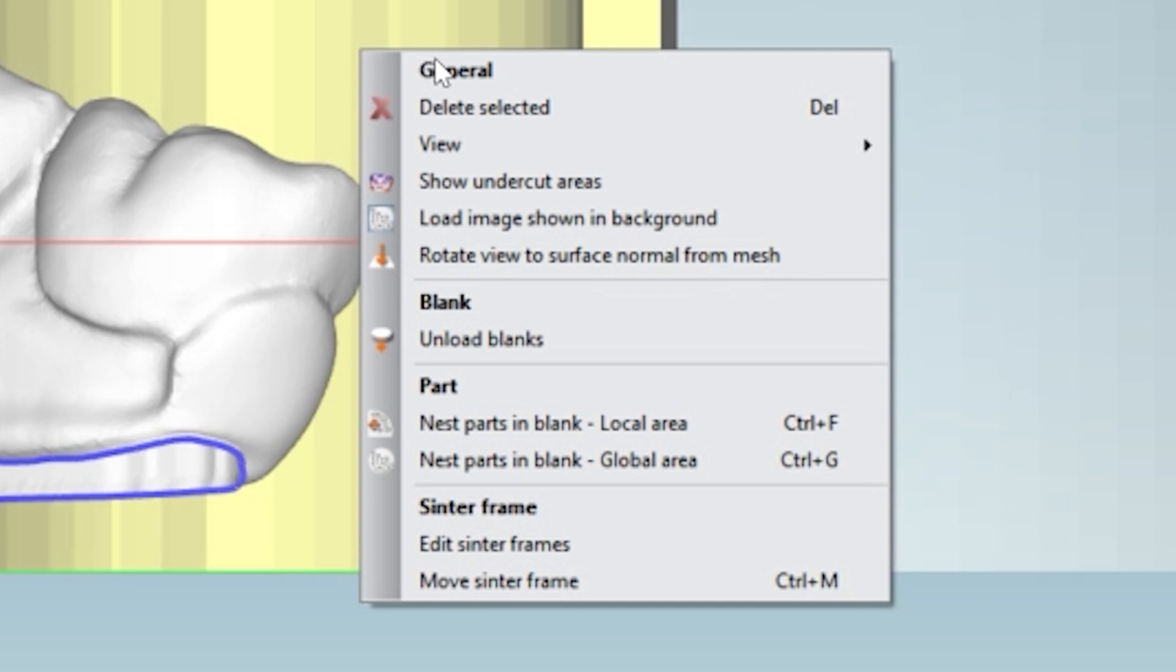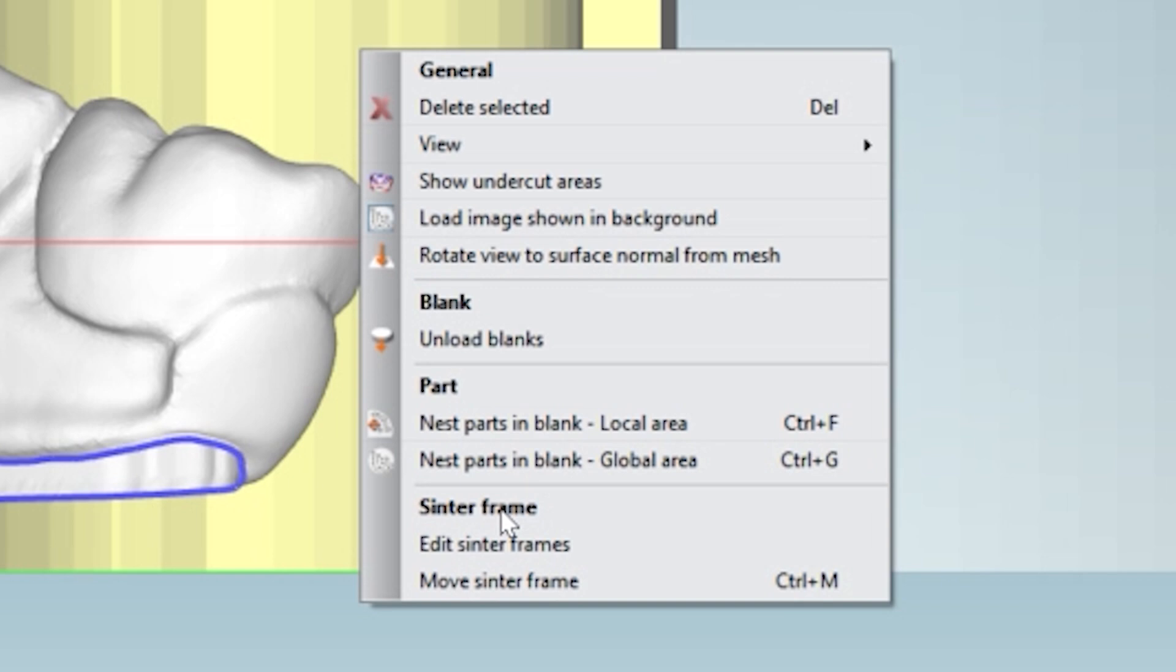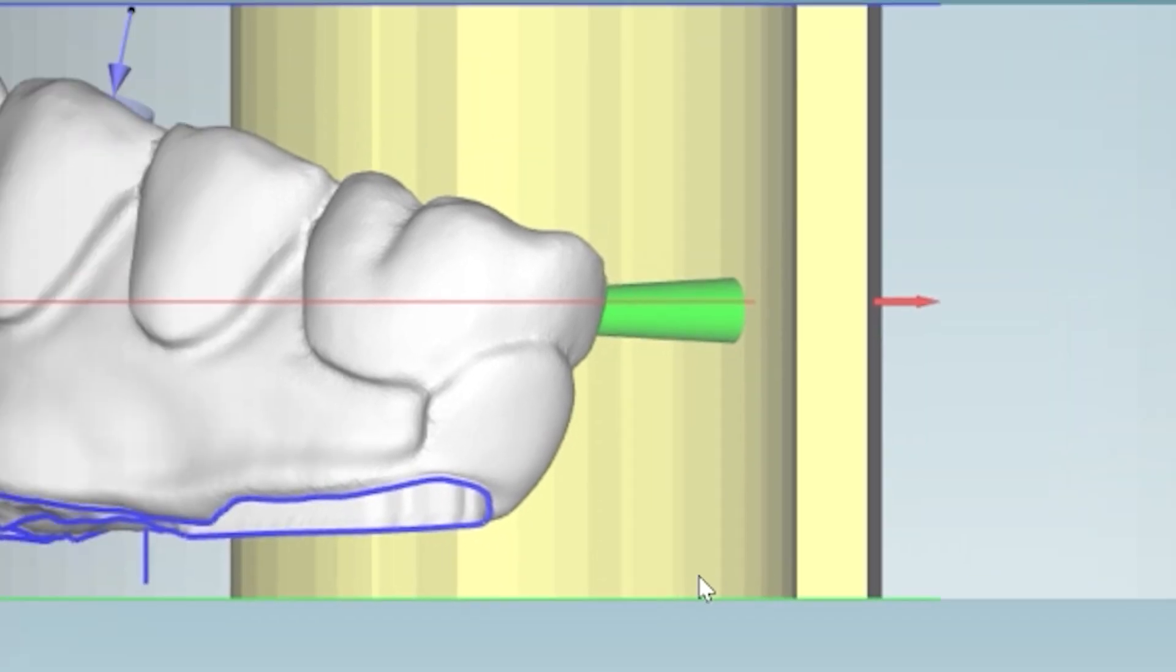After right click, what we're going to do is we want to edit our sintering frame. So come down here towards the bottom. It says sinter frame, and we're going to edit it. Go ahead and left click that button.